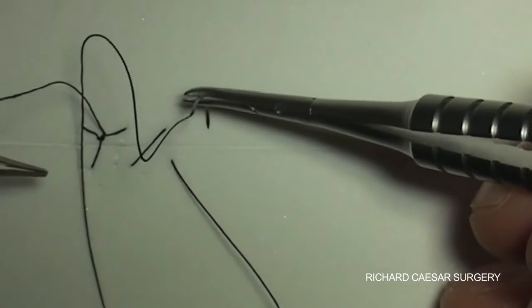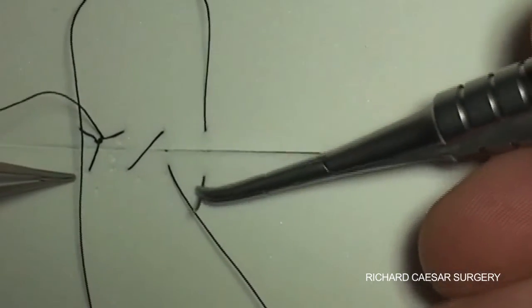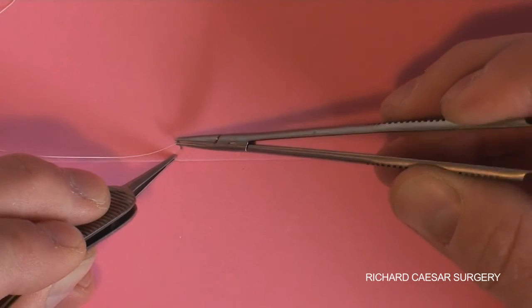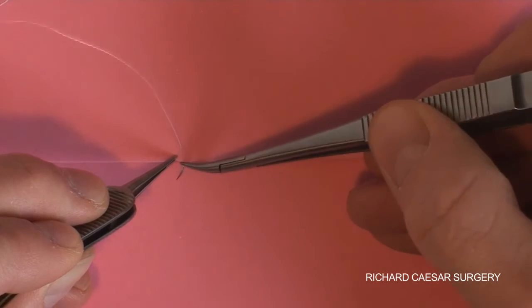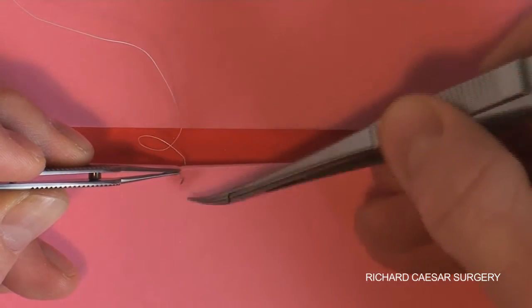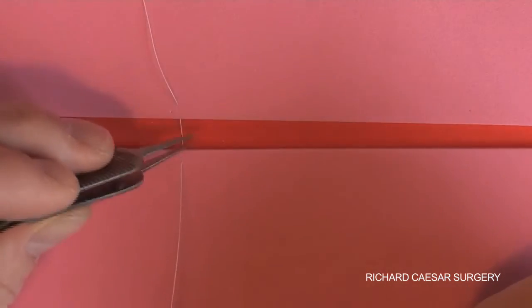The essential idea is that you can place it in one pass if you can pick up both edges, or two passes. What you want to achieve is that as you pull the needle back through, it's ready to go in again. This is deliberately zoomed out so you can see the angle of my fingers. Once you've made your first pass, watch how your thumb knuckle on the needle holder rolls upwards, rolling the needle holder tip over.